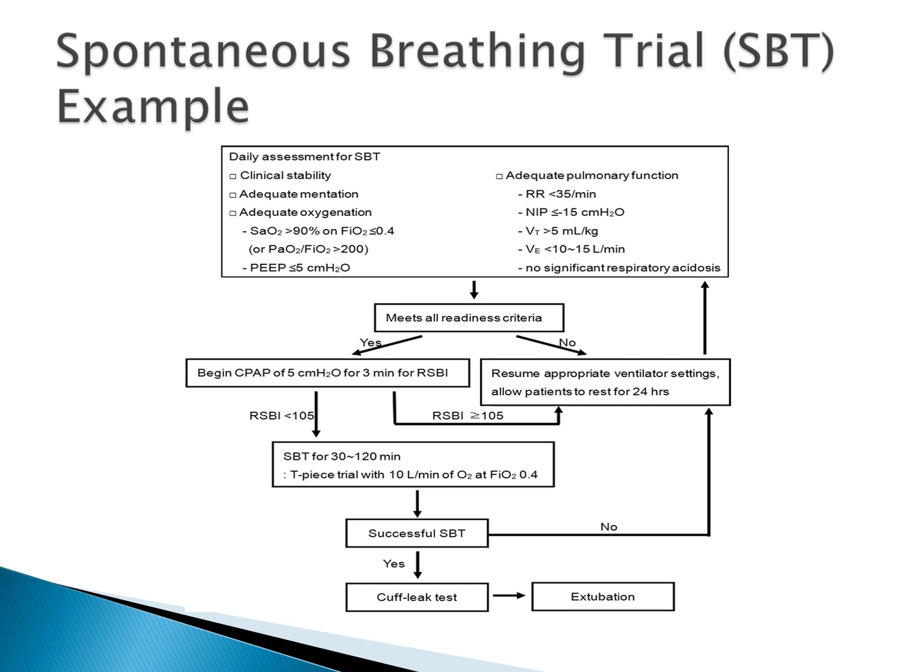And assessing them immediately, but also at various intervals, again, from 30 to 120 minutes. And then, in the next box down, have they met the readiness to wean criteria? If they have, you're then putting them on a spontaneous breathing trial for at least 3 minutes in order to get their rapid shallow breathing index.